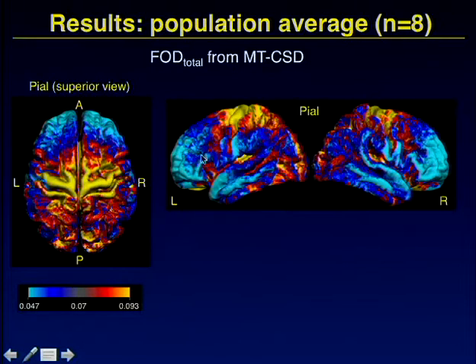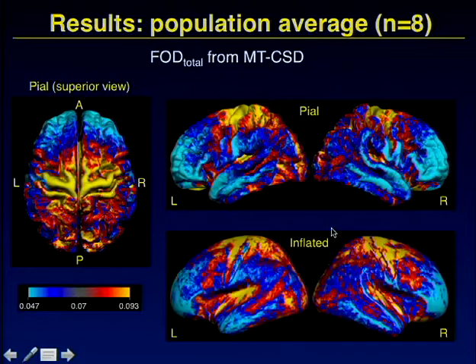Maybe it's easier to see if we open up and you see from the sides, or if it's more common in this field, if you inflate it so you can start seeing inside. And then you get this kind of structures. It's roughly bilateral. You can see it's not exactly one-to-one, but the structure seems to be in both sides.